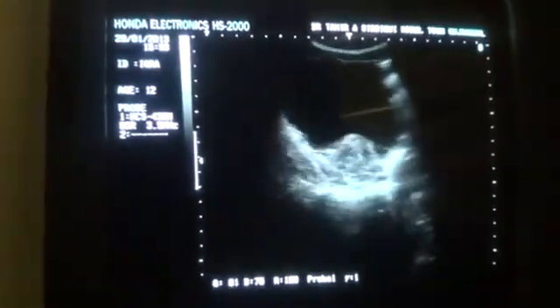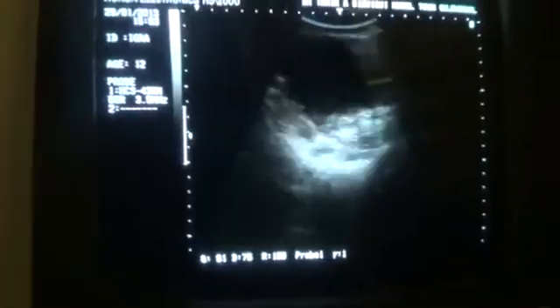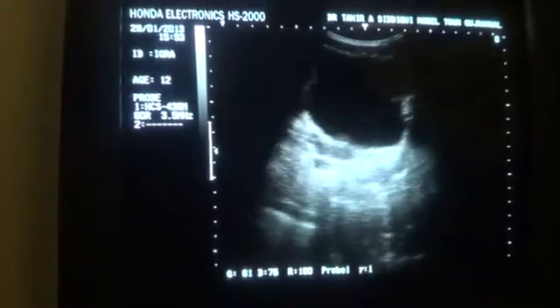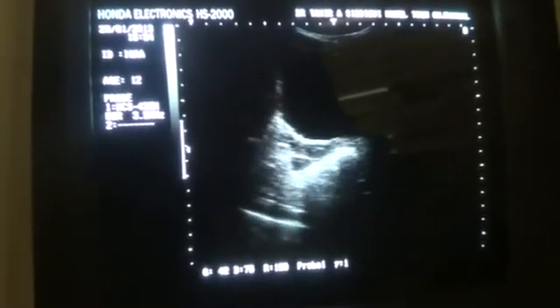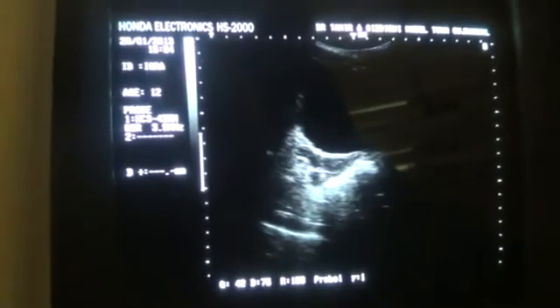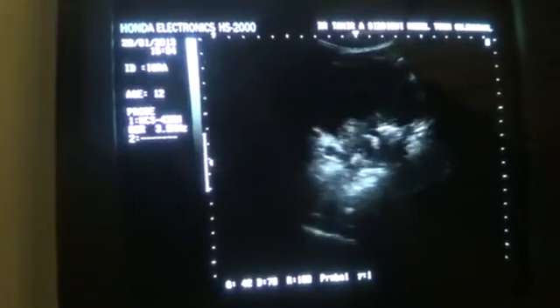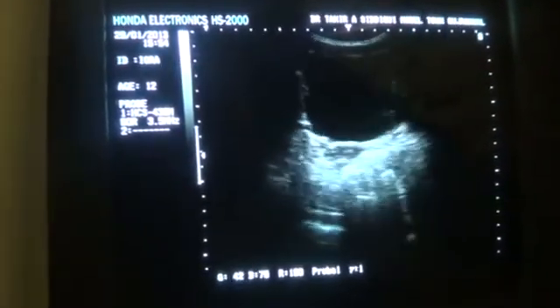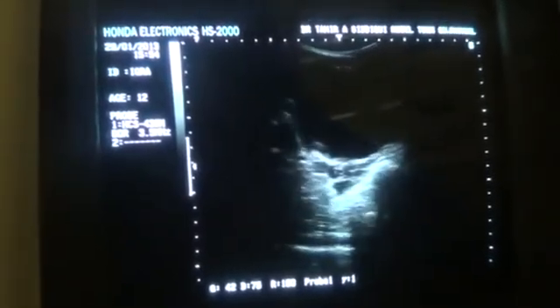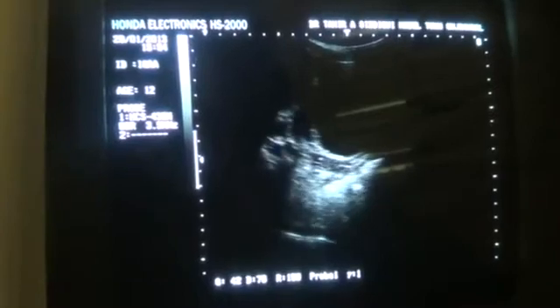So we saw the uterus and the ovaries. These are the ovaries, the cystic areas that you see. And the ovaries, this is one of the ovaries which is placed posterior to the uterus, this area, and is hypoplastic. Secondary sexual characteristics are not developed. There are no pubic hairs. Her breast is not developed at all. There are no hairs. So the ovaries, if I am not wrong, are hypoplastic as well as we see the uterus.